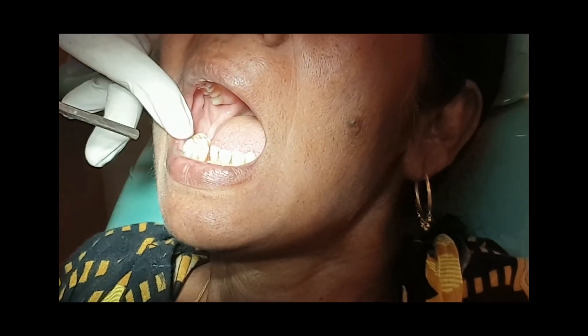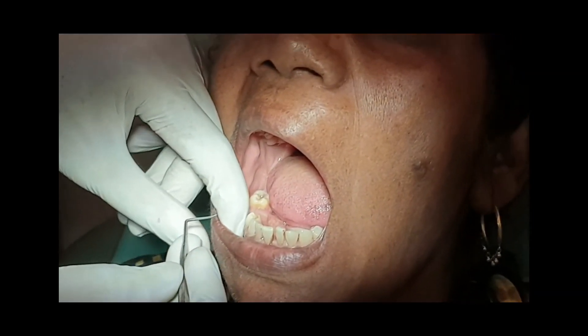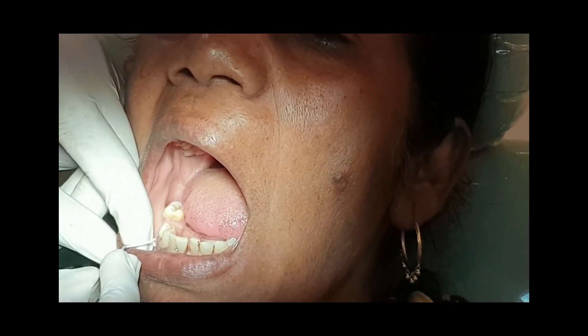After the local anesthetic is deposited, we wait at least 5 to 10 minutes for the nerve block effect to take hold. Subjective symptoms can then be checked on the lower lip on the side where the block was given. For the Lingual Nerve block, we ask the patient about numbness on the anterior two-thirds of the tongue on that side. Subjective symptoms can also be elicited on the teeth anterior to the Mental Foramen, from the premolar to the anterior teeth.